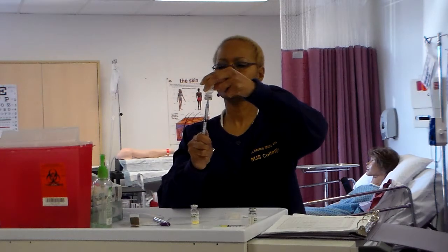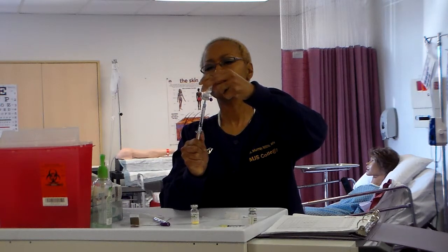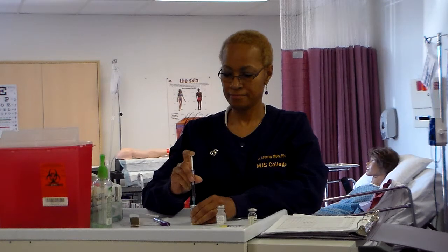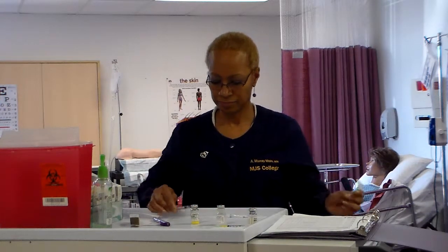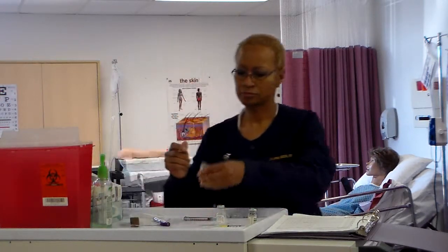Drawing my diluent first. Now into my medication. Okay. Remove needle. Mix medication thoroughly. Roll in palms. Do not shake. And you have to look at it and make sure it dissolves.